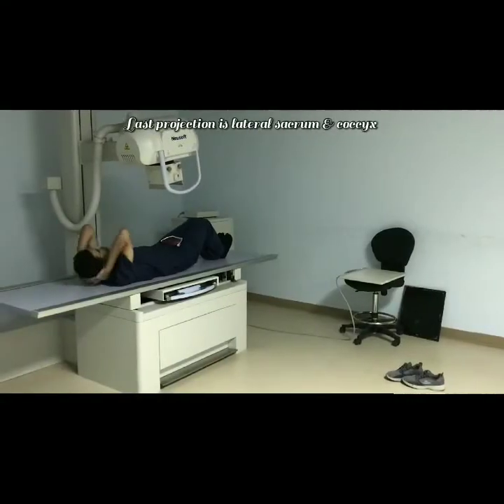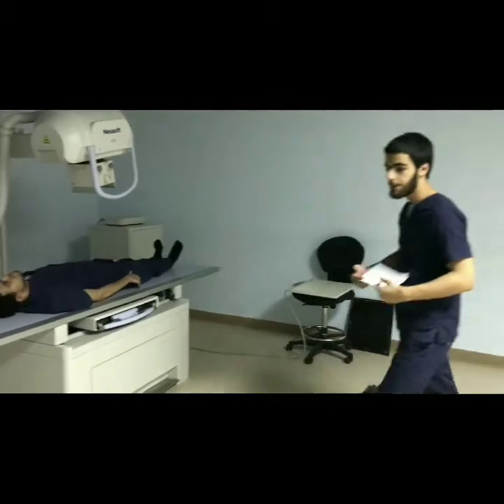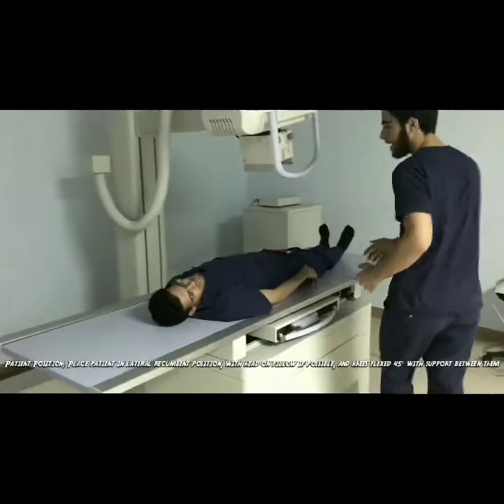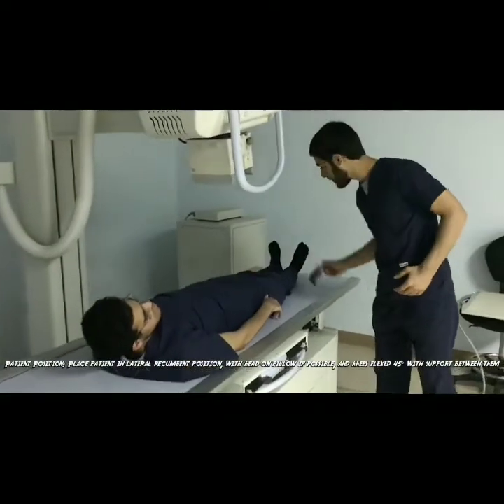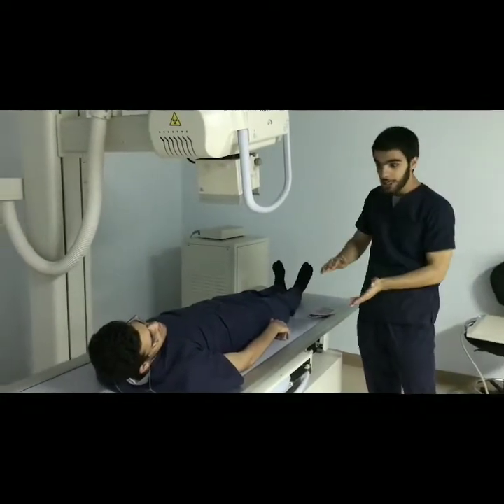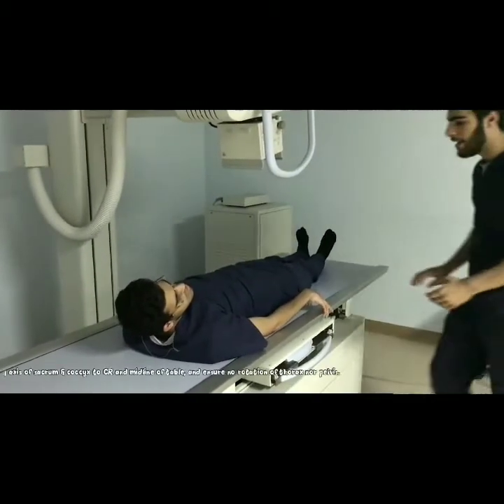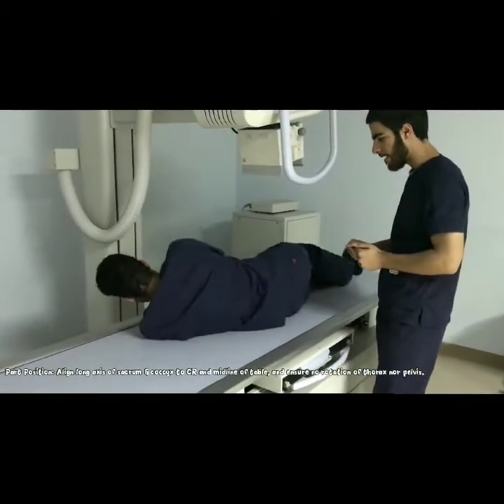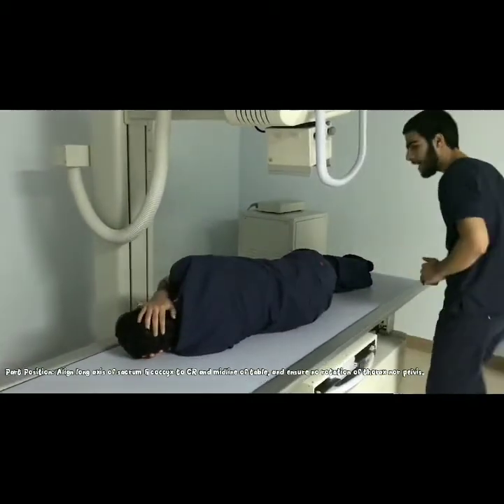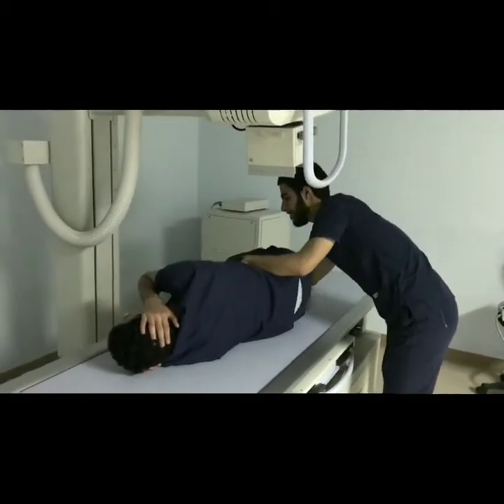For the lateral projection, explain to the patient how to position before he turns to his side so that he is able to see you demonstrating. Take off the gonadal shield and make a full and clear explanation to the patient. Turn the patient to his side and take consent to make a true lateral position. Ask the patient to flex his knees properly with support in between.